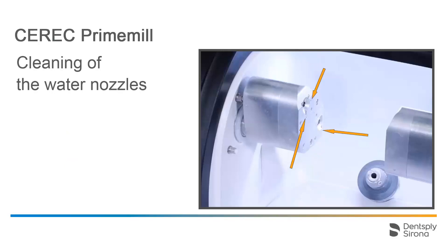In case the water nozzles do not reach the instruments during wet milling or grinding, this will negatively affect the durability of the instruments. Therefore, regularly clean the water jets carefully with a probe to remove any foreign objects.